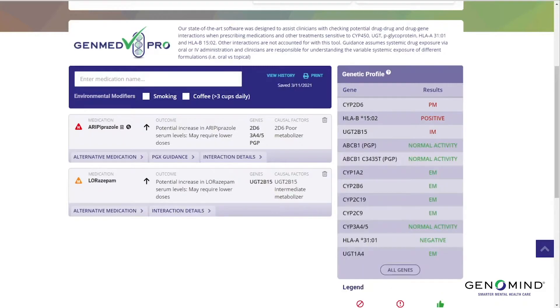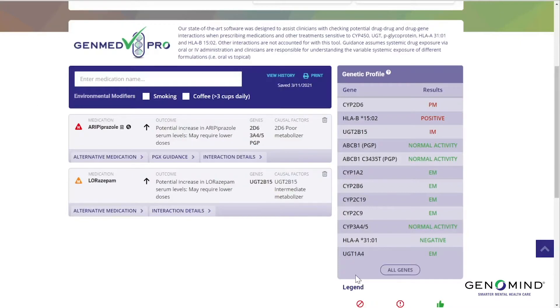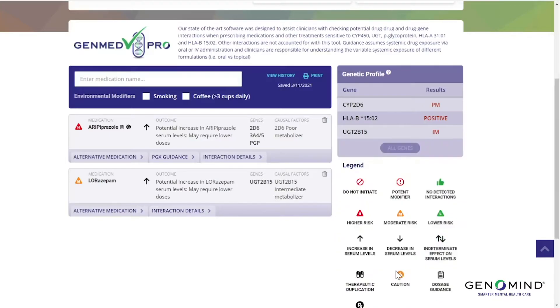Those genes include CYP450, UGT, and P-glycoprotein that influence drug exposure, and HLA genes which influence risk for drug-induced skin reactions. We also allow you to factor in environmental factors that may impact drug levels, such as smoking and coffee. Unlike most drug interaction checkers, GenMedPro evaluates all drugs and genes at once, instead of breaking your med profile into pairs of interactions. This makes evaluating multiple interactions easier.